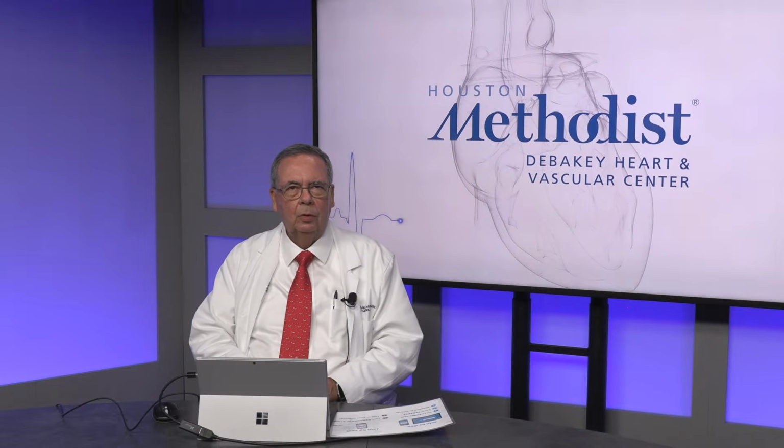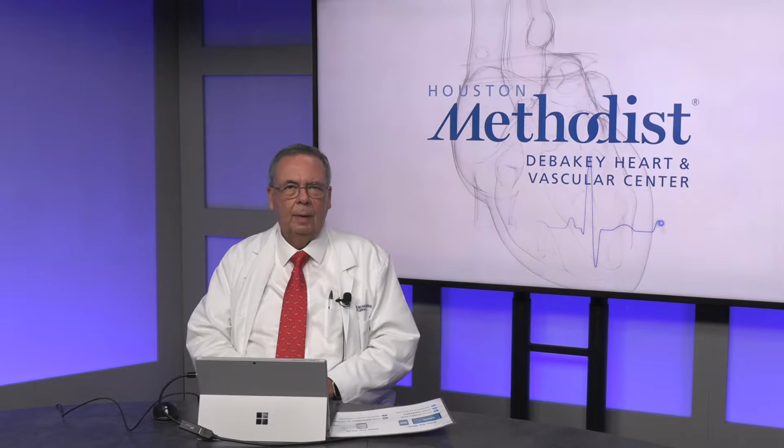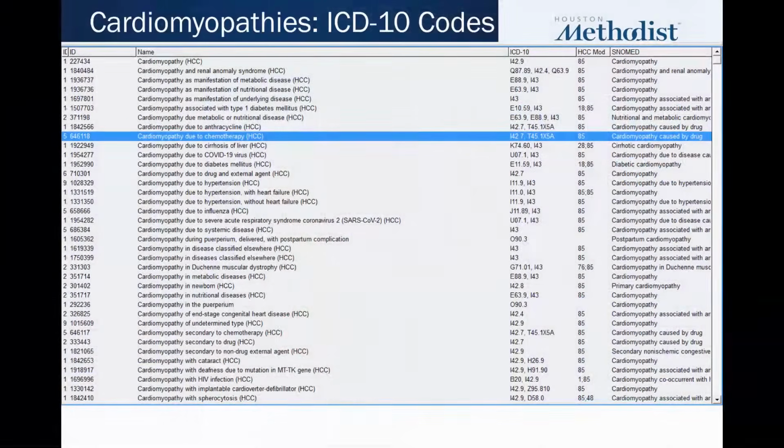So the outline of the talk is going to be pretty simple. We're going to talk a little bit about ways to classify cardiomyopathies, and then discuss the role of echocardiography and, of course, the role of cardiac MRI, which has provided an amazing improvement in the way we can assess patients with cardiomyopathy.